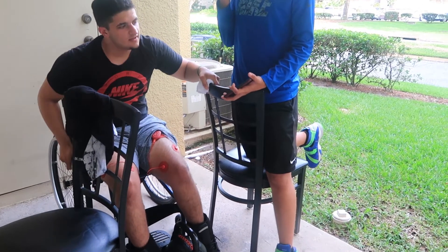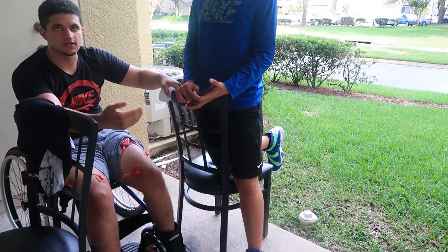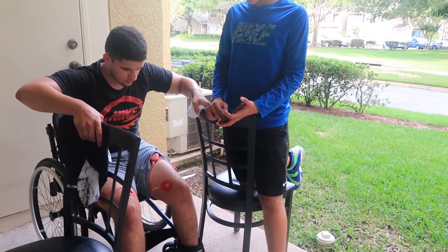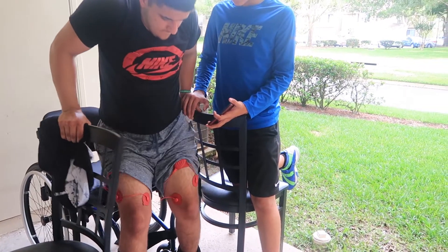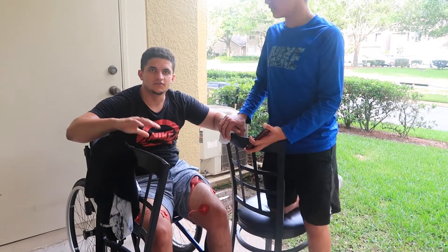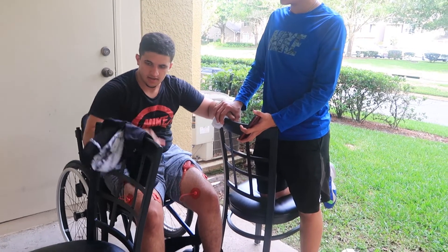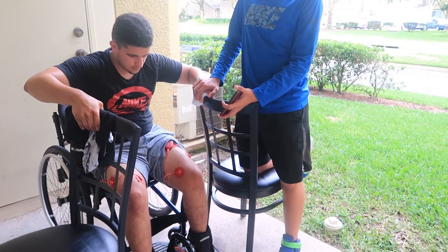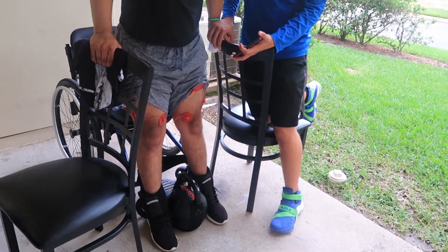Yeah, it does do better. What made you sit down like that? My leg pushed out and was locked, and I couldn't get my hips forward, so my hips just fell back. Okay, I'm trying to let go of some weight on them because my hips are not forward. I'm just falling back again. Interesting — let's see what happens.